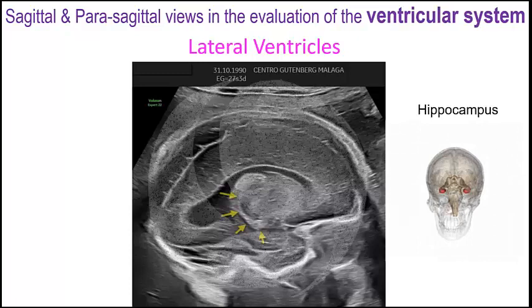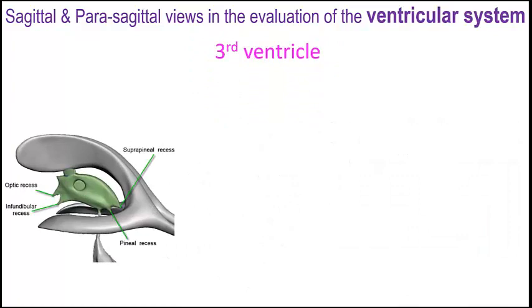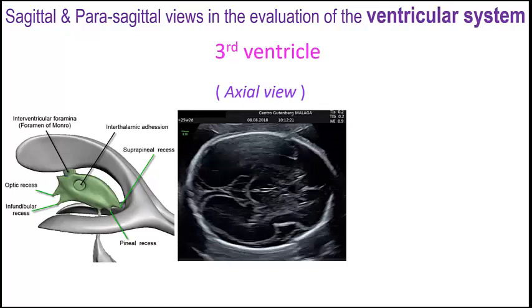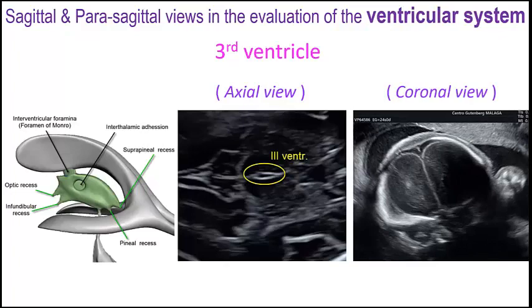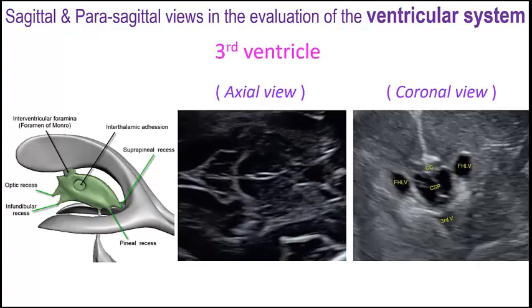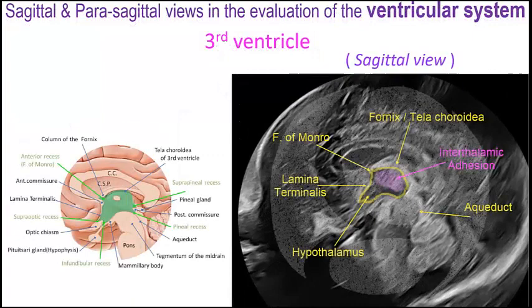The third ventricle can be seen in normal conditions in the axial plane as two parallel lines separating both thalami, and can also be evaluated in the coronal planes below the cavum septi pellucidi. But the best approach to display the third ventricle is the sagittal plane, where we can nicely demonstrate its shape and boundaries. Don't forget to check the interthalamic adhesion.